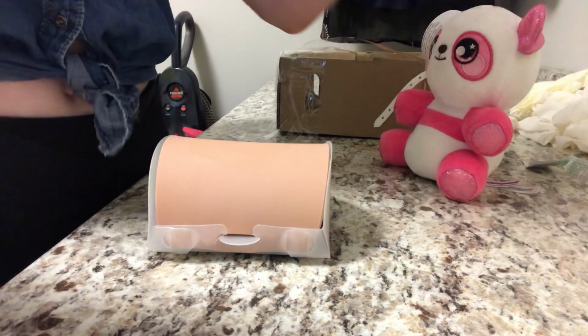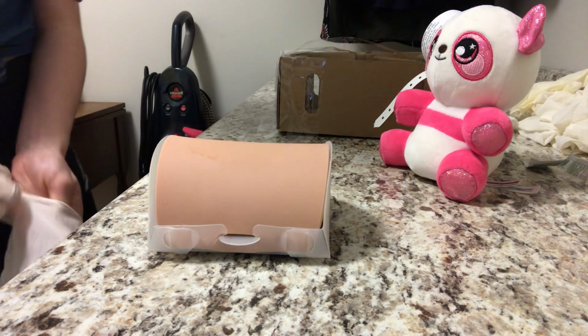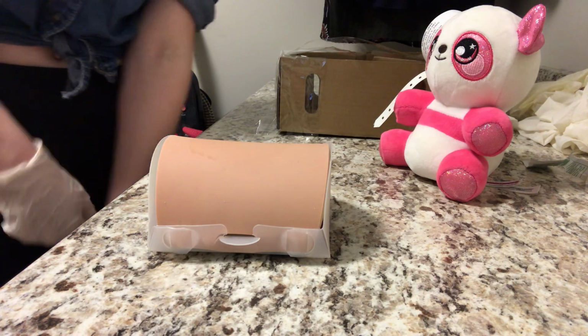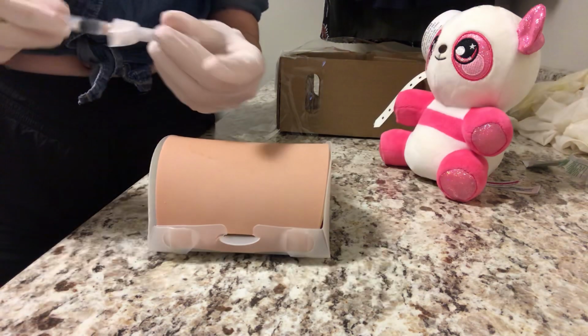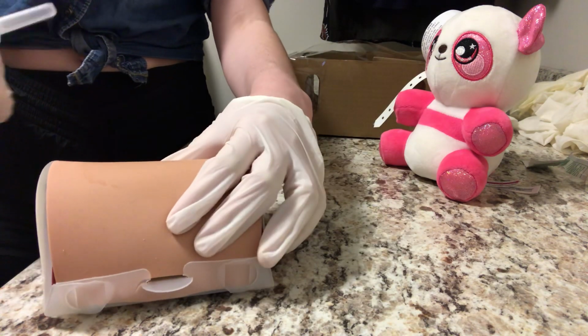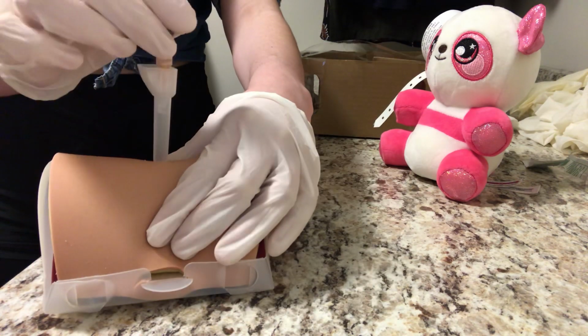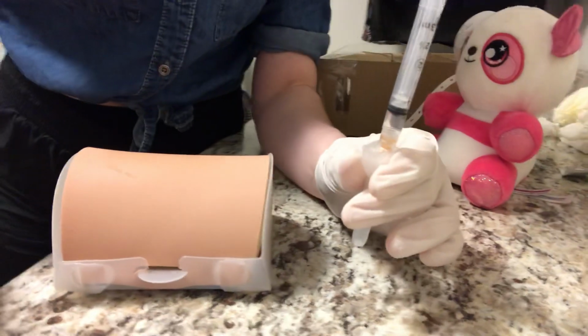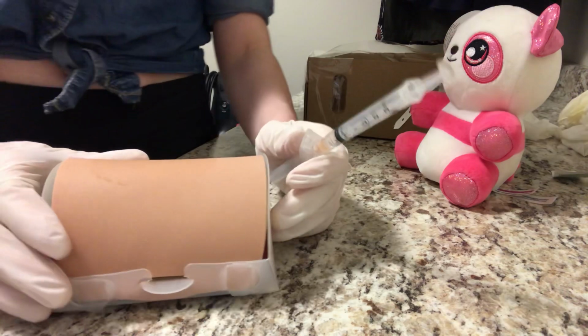And of course, I do hand hygiene before this, as I already verbalized. So with a subcut injection, you give it 45 degrees for every inch of tissue you can grab. And in this case, as I said, my patient is larger, so I'm going to be grabbing 2 inches, and I'm going to go in on a 90 degree. Can you see okay? Okay.